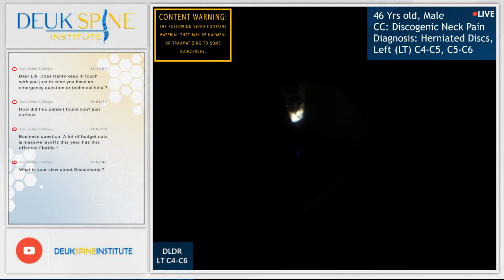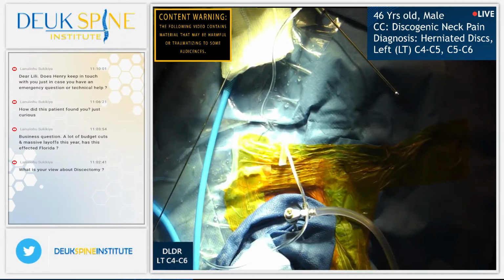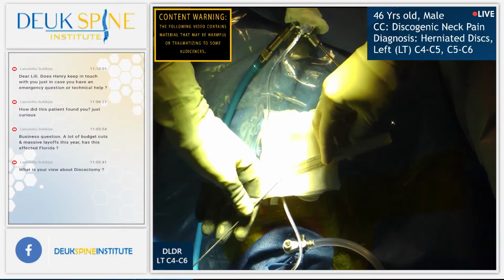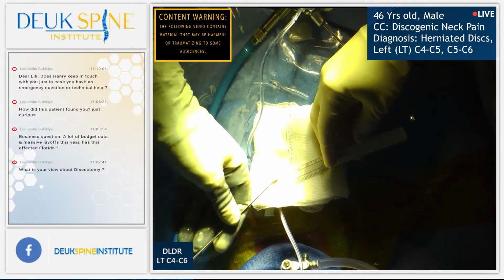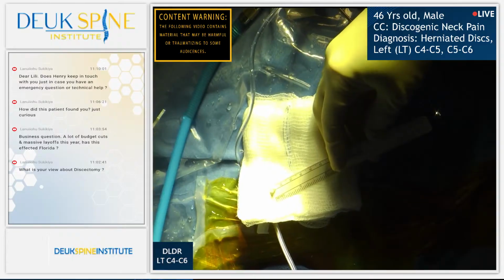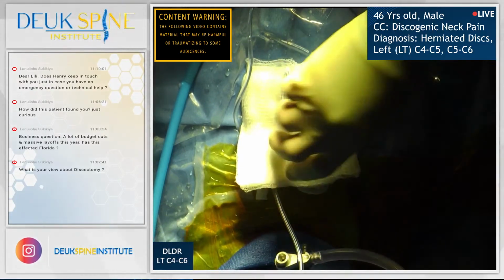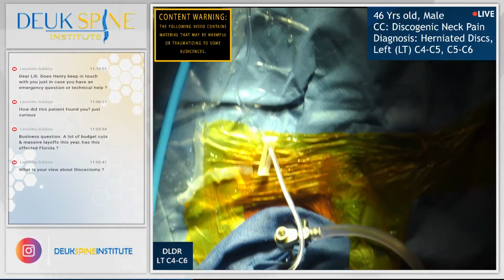And the reason is that it's not compression by size, pressure by size, that causes symptoms. Look at that herniation, guys. This is a beauty. Can you see this, Lily? Yes, we can see it. This is a pretty good size herniation. Look at that, it's 5 millimeters. A good size herniation. And we've already taken out several of them, but that was a pretty big one.